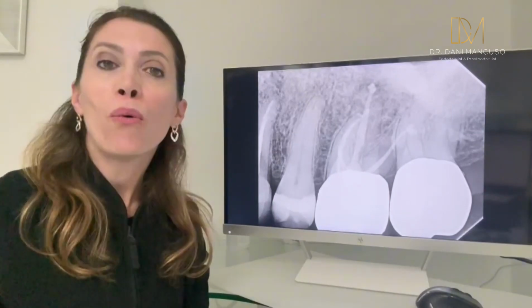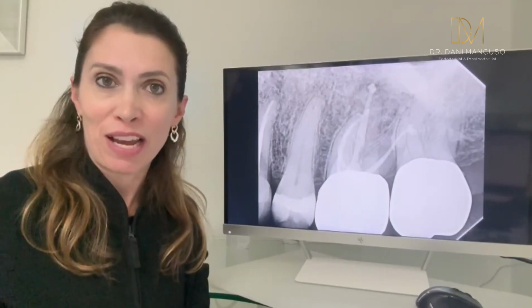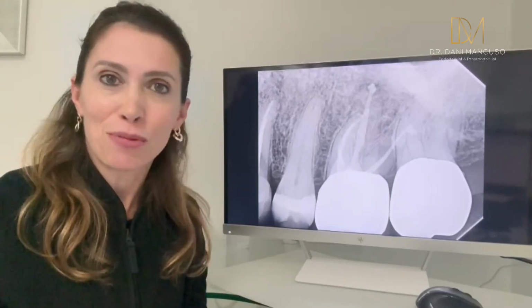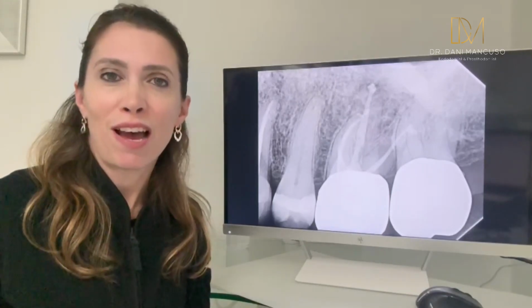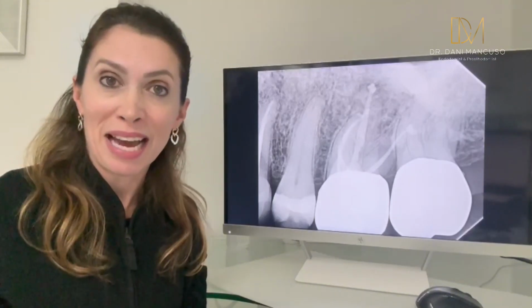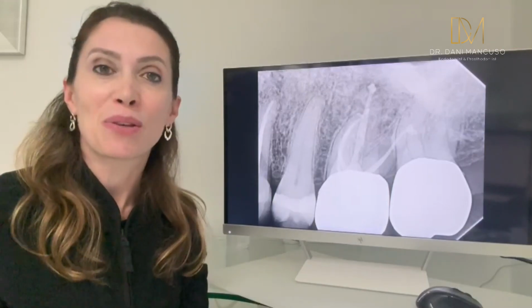And remember, always gauge your GP before your obturation. Take an x-ray with the GP and sealer together so you can fix whatever is wrong. Don't just rely on the size fit according to your system. Go with the anatomy of the canal and use the CBCT if you have that available, because it always helps.